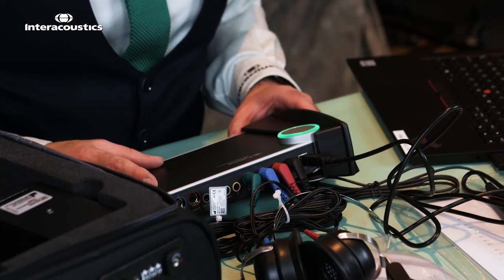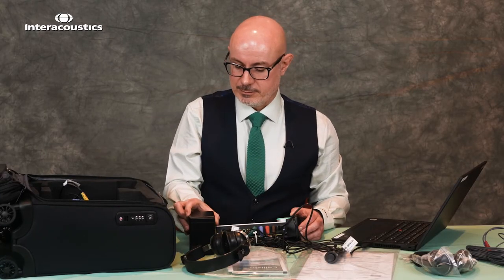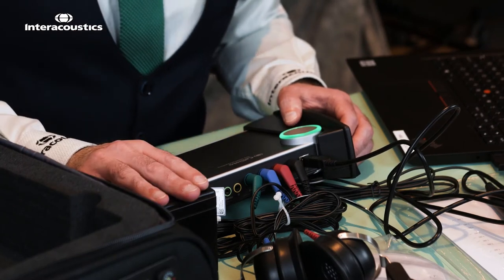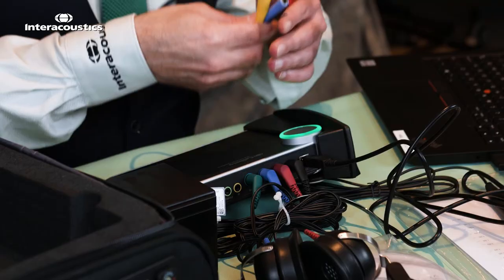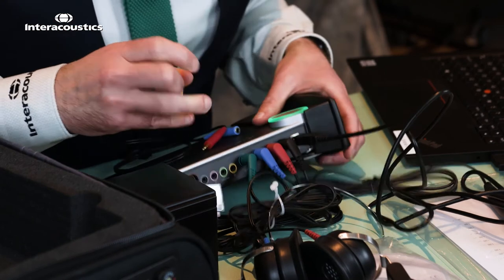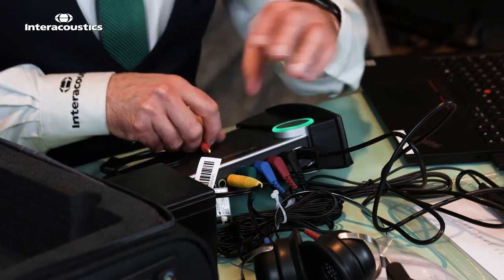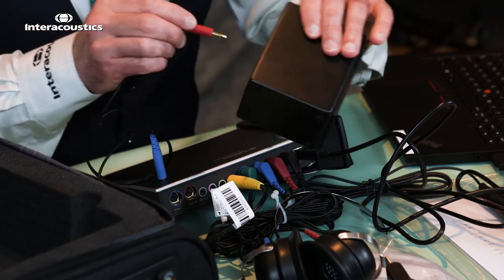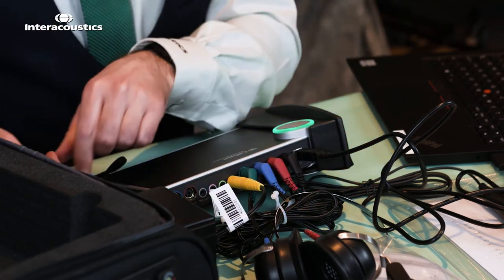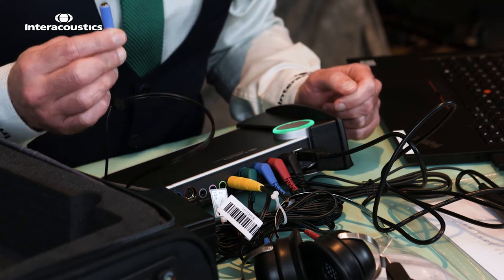Moving now into setting up for the REM solution, we'll take the speaker from our bag. This speaker can be used for speech testing and also for the REM solution. The connections are different colours: the yellow connection goes into the back of the Callisto into the free field port ready for the speaker solution, the red connection goes straight into the back of the speaker and is ready and powered, and the blue connector is for any additional speaker you may want to attach in the future.